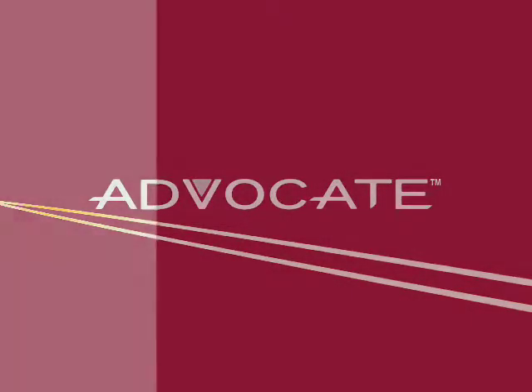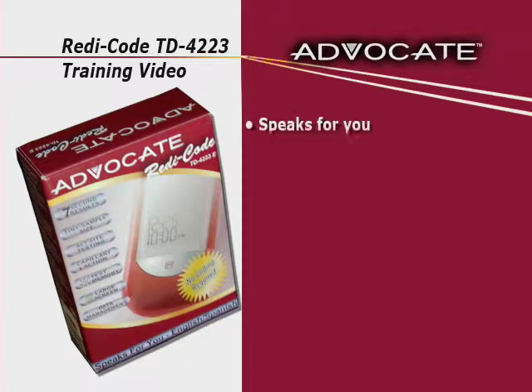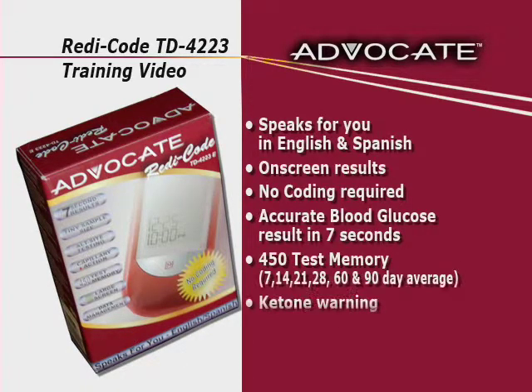As an Advocate system owner, you have chosen one of the best blood glucose monitoring systems on the market today. This training video, in conjunction with the Owner's Manual, contains important information about your system.